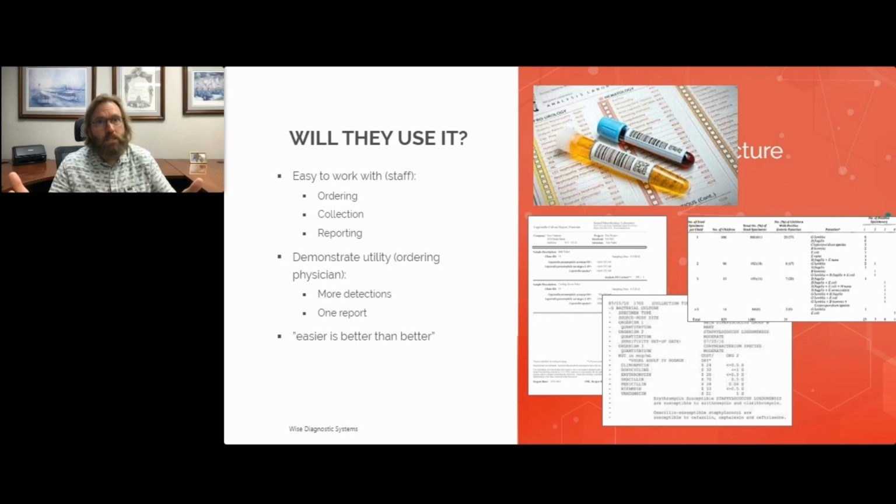Waiting for 2, 3, 4 days for a pathogen, and then maybe a day or 2 after that for sensitivity to figure out which antibiotic to use. Typically, what our experience has been hearing from physicians is that they will order the tests, but then based on symptoms, they may prescribe something empirically. Well, if they say, hey, you just got to wait till tomorrow to get that result, one that helps to foster antibiotic stewardship by just waiting that 1 extra day to give them the right med the first time. And it saves the patient from maybe getting on an antibiotic that isn't going to work, that then has spent the money on it, that then has to get another prescription based on the one that could work.